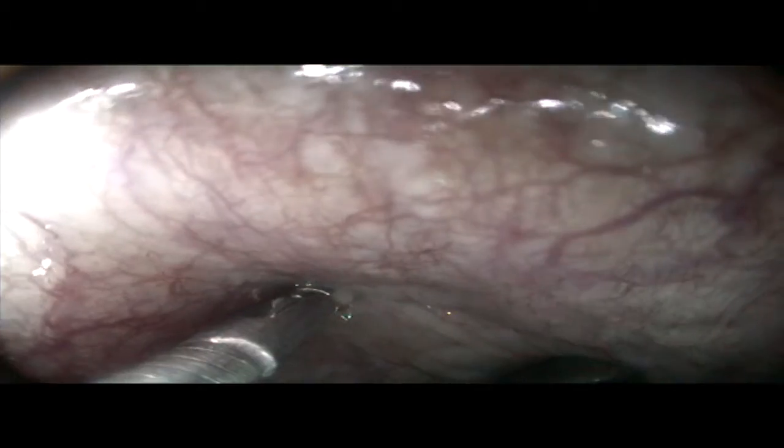Constant barking can produce tracheitis as well. Some infectious forms of tracheitis are very contagious. The cough can be mild and occasional to constant, deep, and hacking. Diagnosis is based on clinical signs, examination findings, response to treatment, and sometimes blood work, X-ray, or various other lab tests, for example endoscopy.